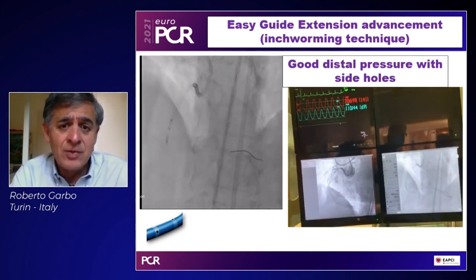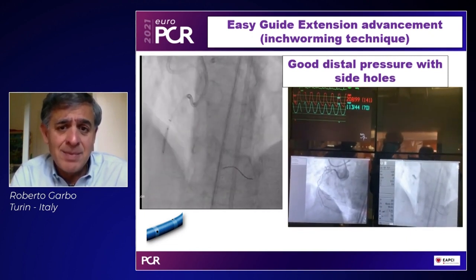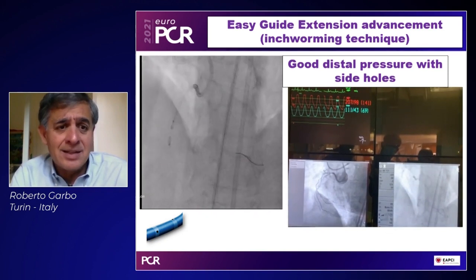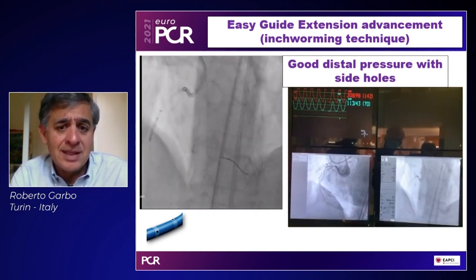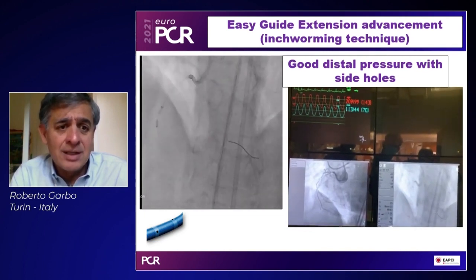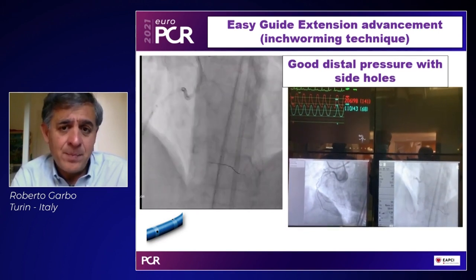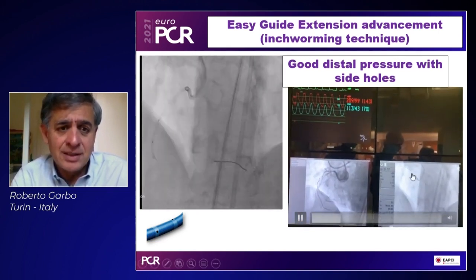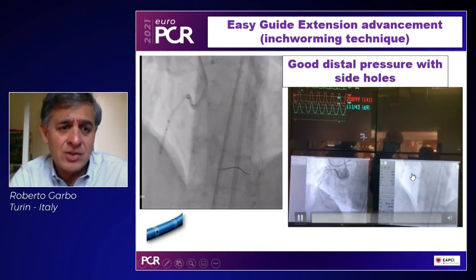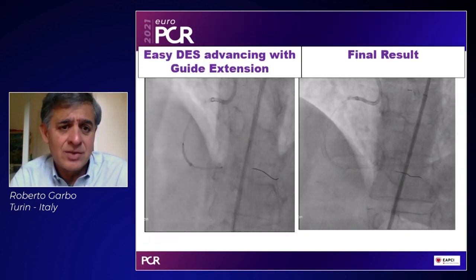And in the video on the right, you can see the pressure is maintained at more than 100. And this is important. You can see how it works with the side hole. You can see the pressure on the screen, even with the guide extension so distal in the distal right, while advancing.